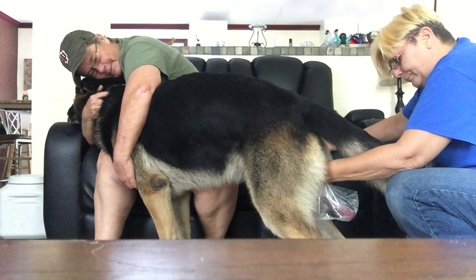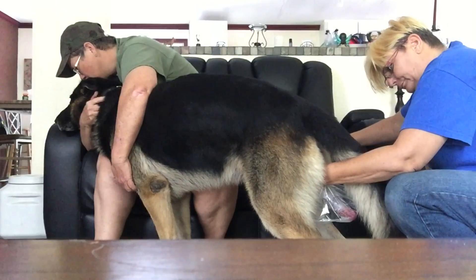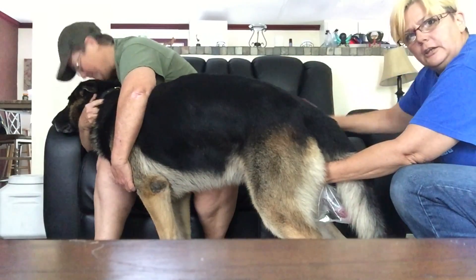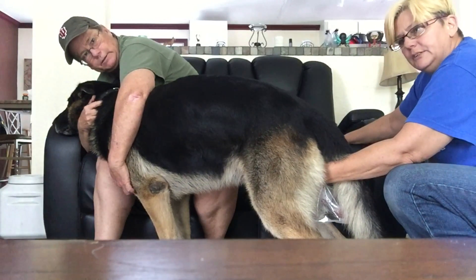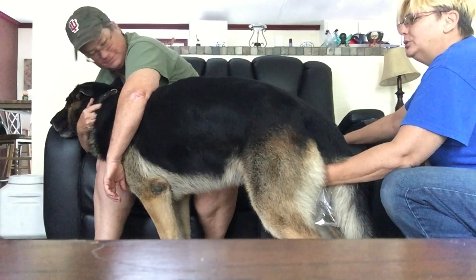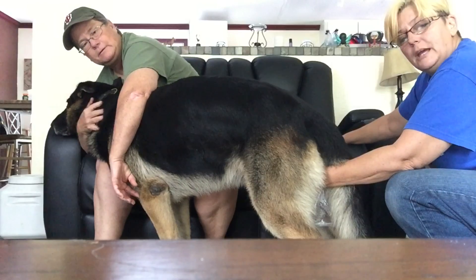You want to make sure you get a really good collection, so you take your time. You have the first part as a fluid — that's the prostatic fraction — and then you have the actual semen, and then you have more prostate fluid after that. We'll also show putting the semen inside the female German Shepherd. This is our volunteer Tycho. He's from Key West Forty. He's a really good boy. Some ties on dogs can last 5 minutes up to 20 minutes or so, and this gentleman stays a very long time, so he's a good strong breeder. He's drooling on the couch and Dale is having to hold him up because he's over it. I don't need any more because he's filled this up quite well, and I'll show you the fraction of semen we have in here shortly.